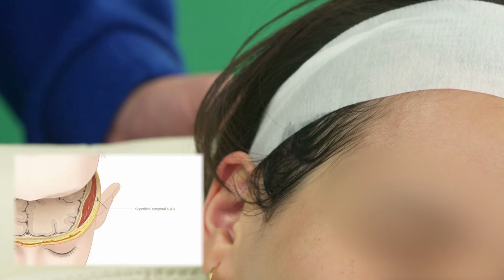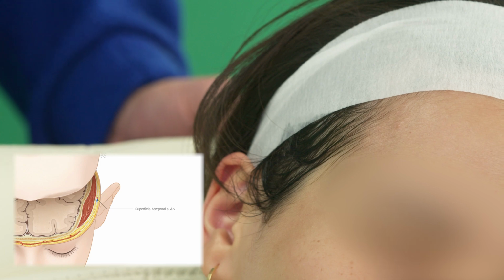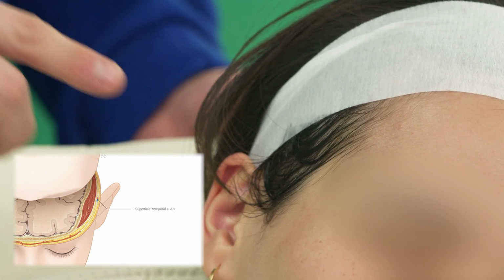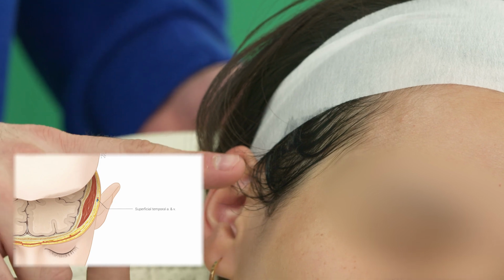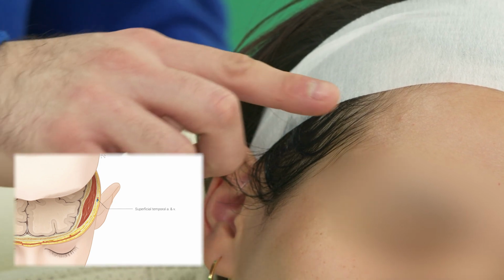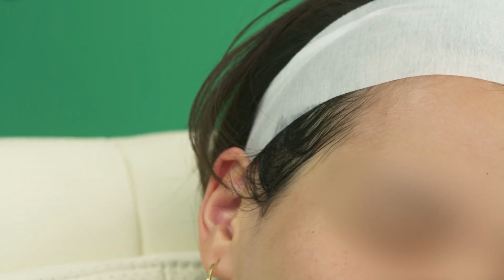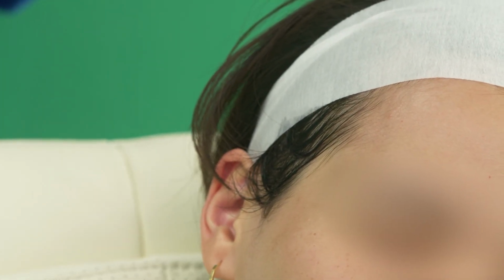The superficial temporal artery is located in the superficial temporal fascia, and it runs between the tragus and zygomatic arch to then branch off into the frontal branch and the parietal branch. Those branches could be located in the region where most of the above-mentioned procedures are performed, becoming vulnerable to damage by a needle.